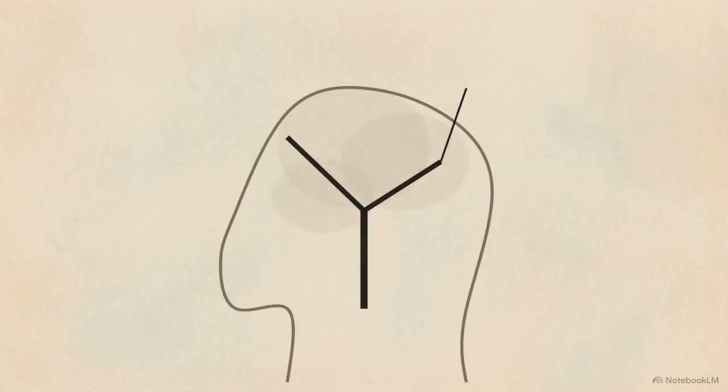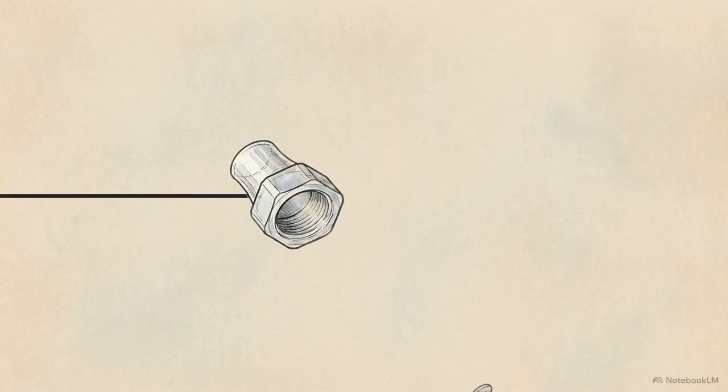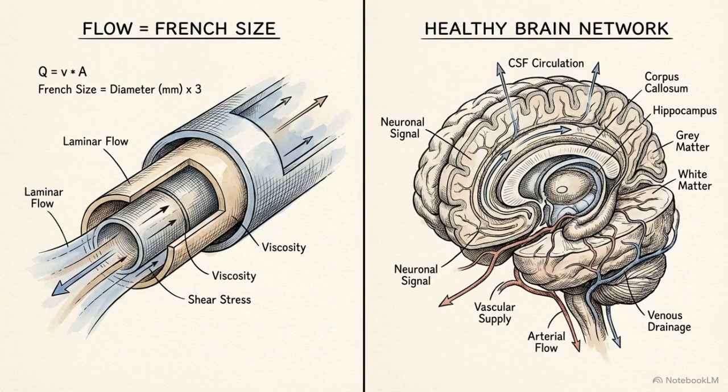Procedures above the clavicles, like cerebral angiograms, require a rigid double flush protocol. Even a microscopic air bubble or thrombus in the brain causes a stroke. The operator aspirates until blood clears the catheter, but then that syringe is discarded entirely. A brand new, sterile, air-free saline syringe is attached for the actual flush. Strict adherence to flow equations prevents the system from rupturing under pressure, while double flush protocols guarantee that 0 lethal artifacts are introduced into the neurovasculature.